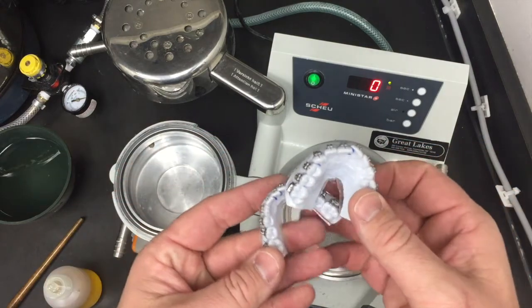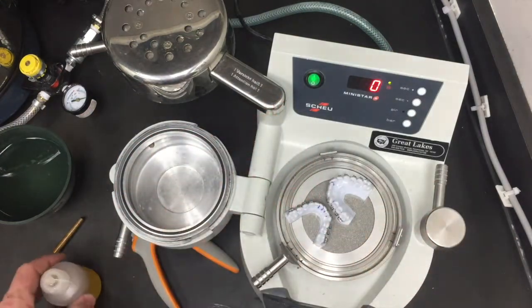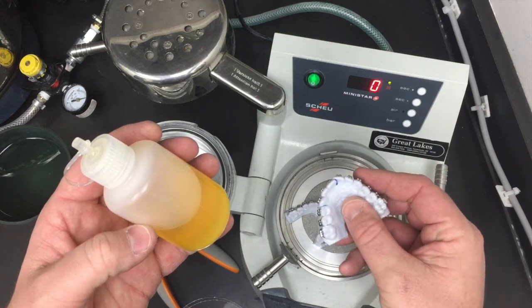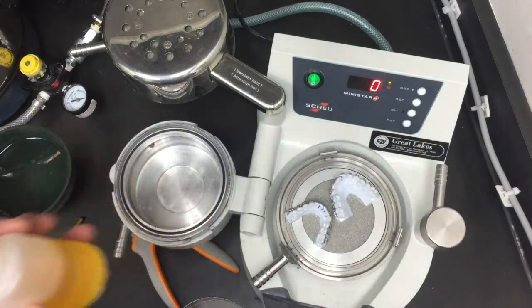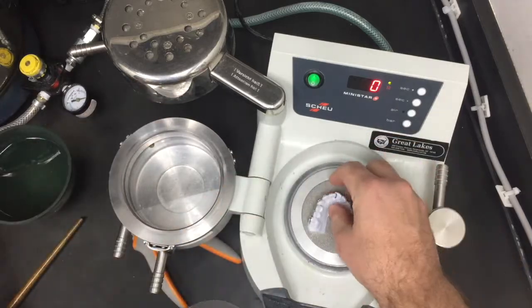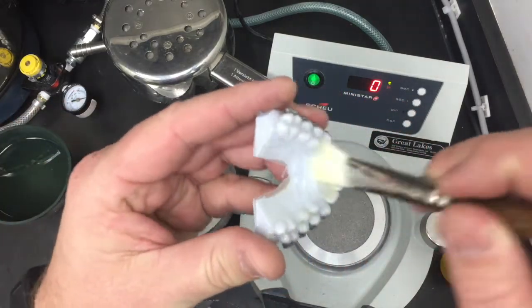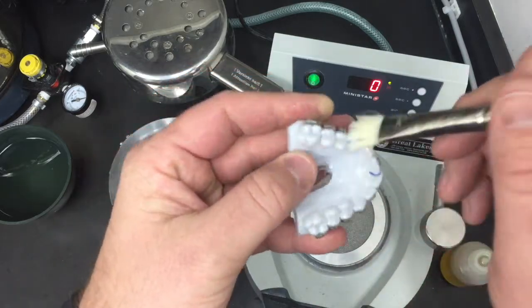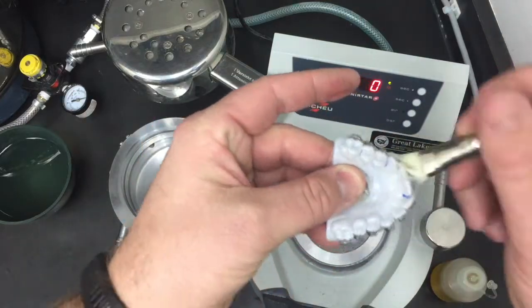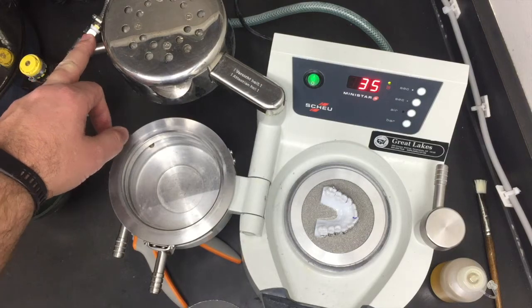Now before we put on the hard stuff, we have to apply our separator, which is PAM oil. We'll actually brush it on the models and that'll act as a separator between the sports mouth guard material and the hard Essex. We will set our timer to 35 seconds for the Essex material.